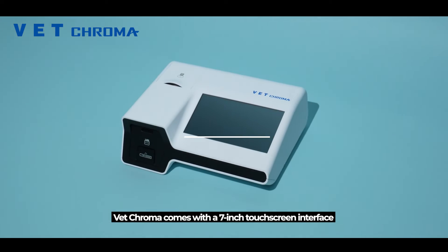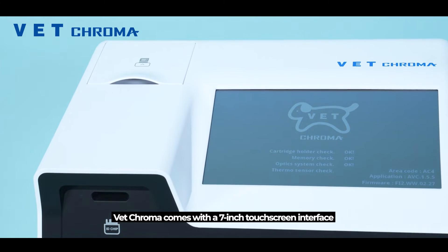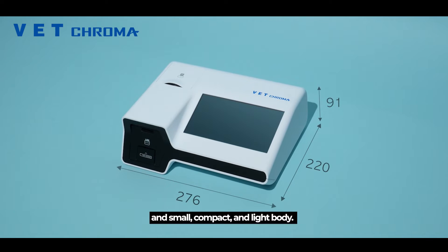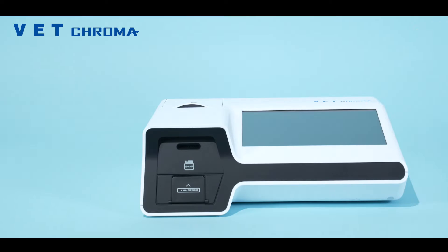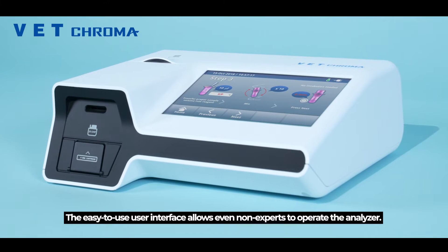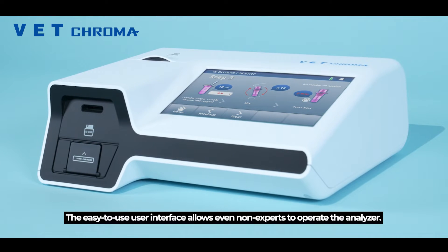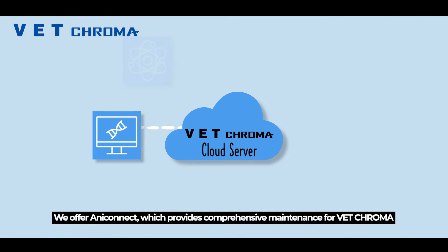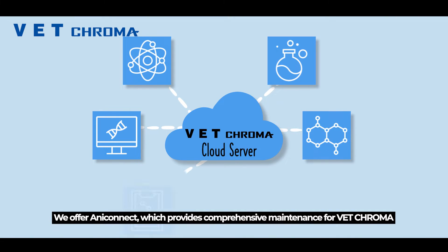VetChroma comes with a seven-inch touchscreen interface, a built-in thermal printer, and a small, compact, and light body. The easy-to-use user interface allows even non-experts to operate the analyzer.